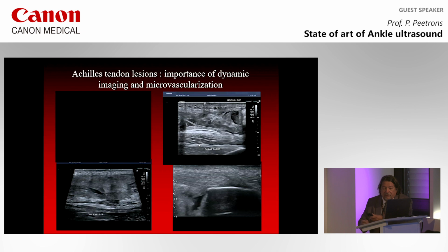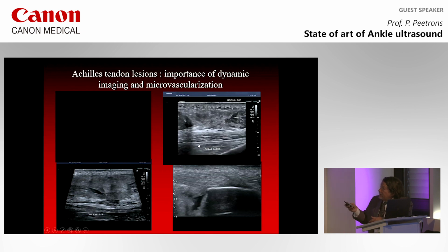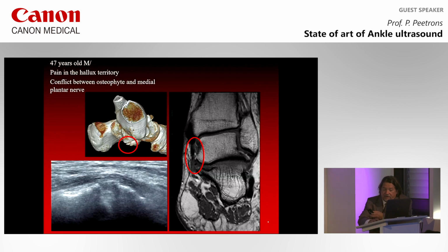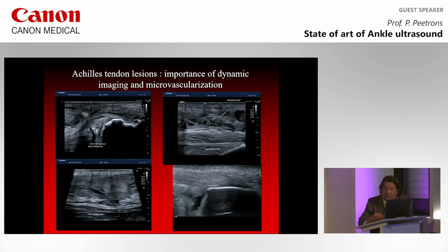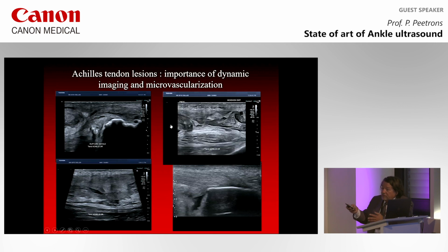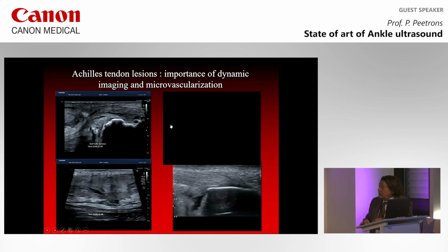In this other example, you can see that this part is moving with the foot, and this part is not moving with the foot. So you can exactly measure where the 2 stumps of the tendon are. One part is there, and the other part is there. And you can measure and tell the surgeon that he has maybe 2 centimeters between the 2 parts of the tendon.